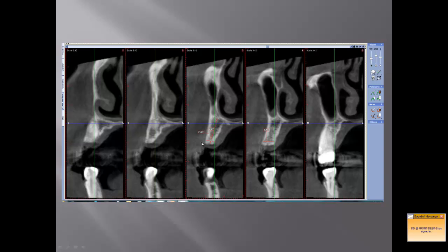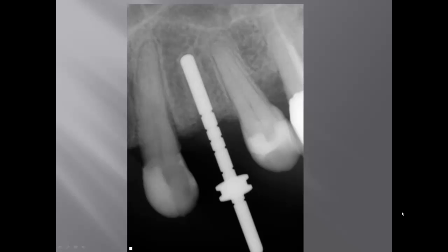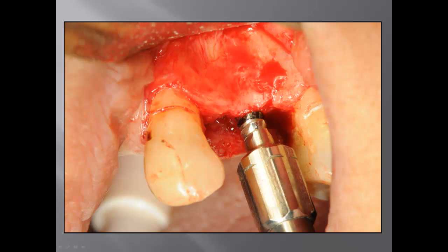For the surgery, I first use a pilot drill to determine the position of my implant and how it will relate to the final prosthesis. I take an initial picture to confirm I'm in the right position, and then proceed with further surgical steps. You can see the pilot drill went down to a certain depth and I'm verifying the angulation before moving forward.